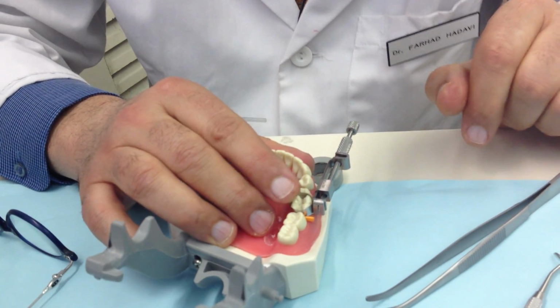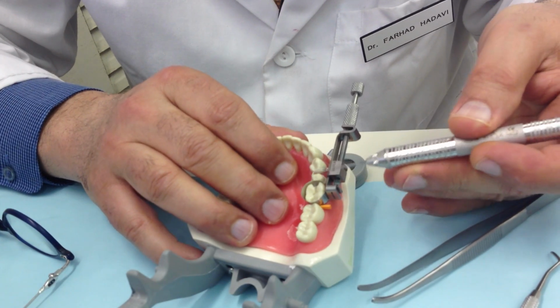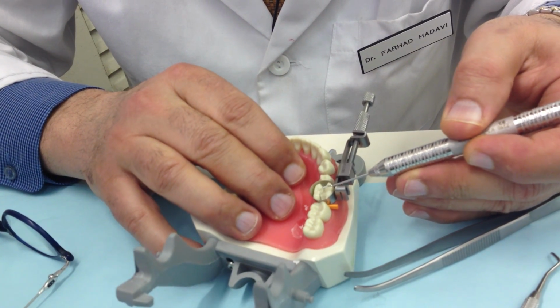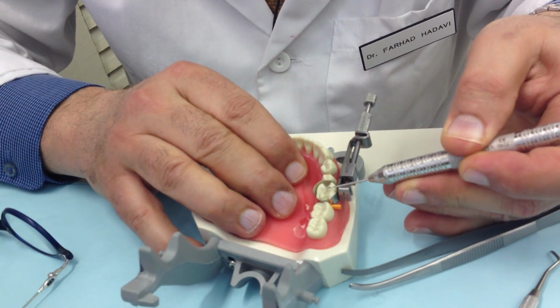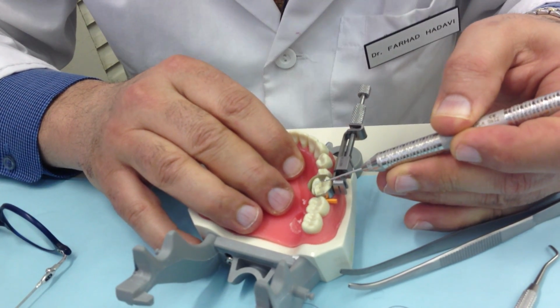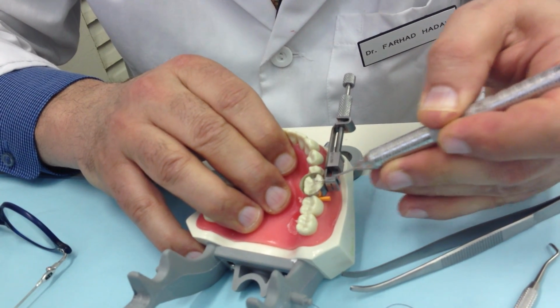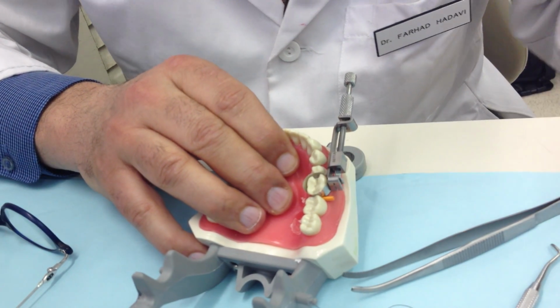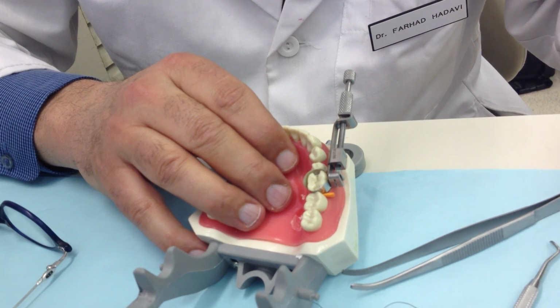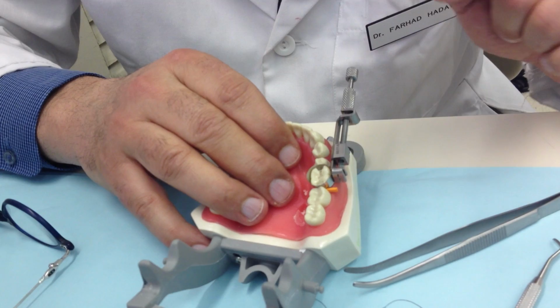When I place my wedge, the first thing that I'm going to do is check this cavosurface margin. You can see I place it over here and push it. Can you see that one? I just don't place it over here and look at it. I place it over here and nicely push it to see if there is a slight opening. Then I'm not going to place amalgam until I correct that one, correct?